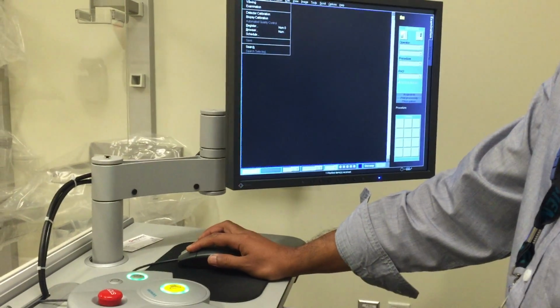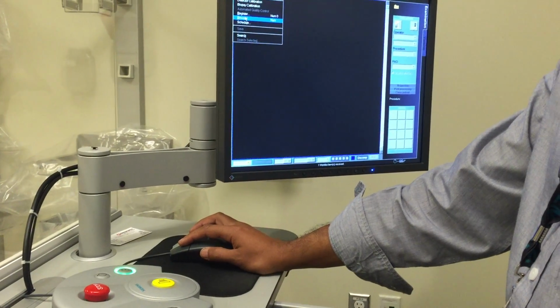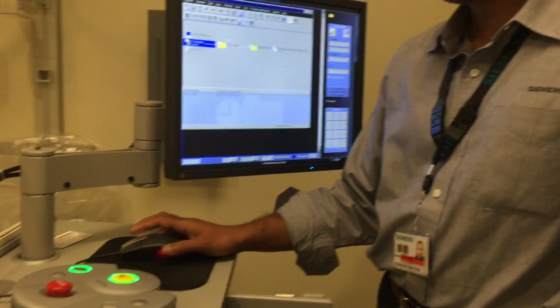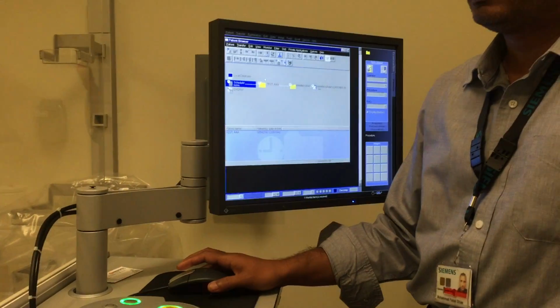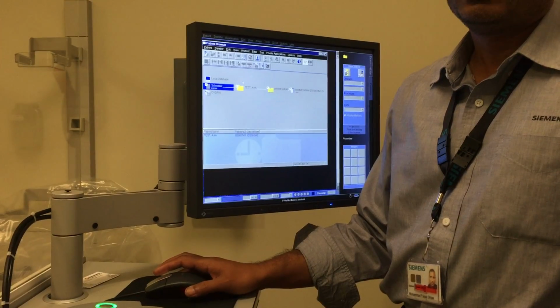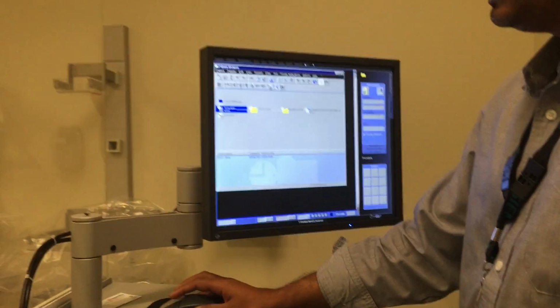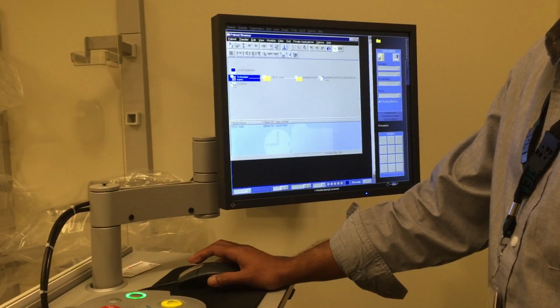Is it the same software like you have in ultrasound, the S2000 type of things? That's right. Mostly our Siemens systems have syngo. Most of our modalities are syngo based, but there are different versions. So for ultrasound it is syngo US Workplace, and this one is also pretty much the same. Same functionality, same tabs. Some additional depend on the modality.